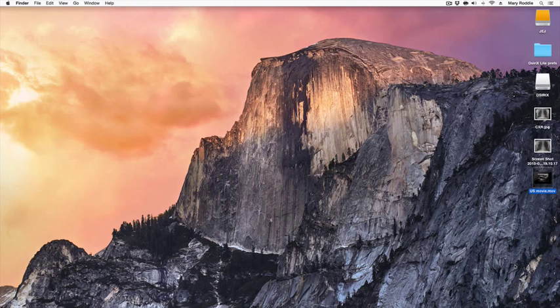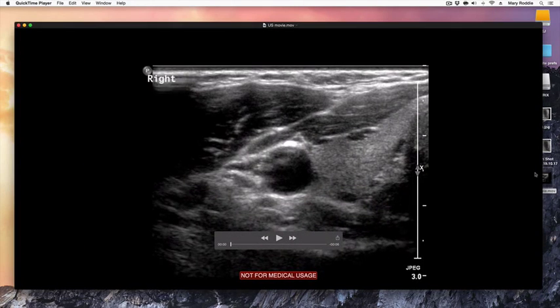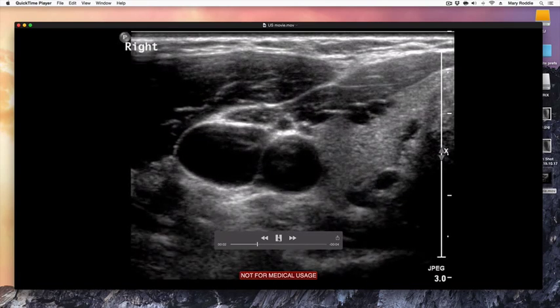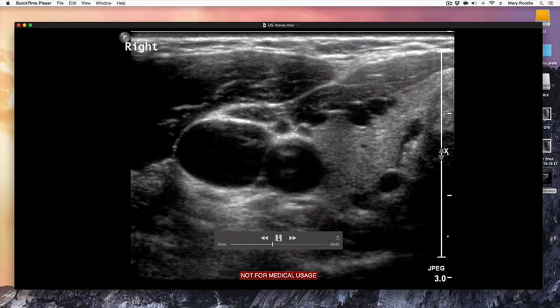My movie is now on the desktop, ready to be imported into another medium, but you can see that it does have the 'Not For Medical Usage' logo burned onto the file.